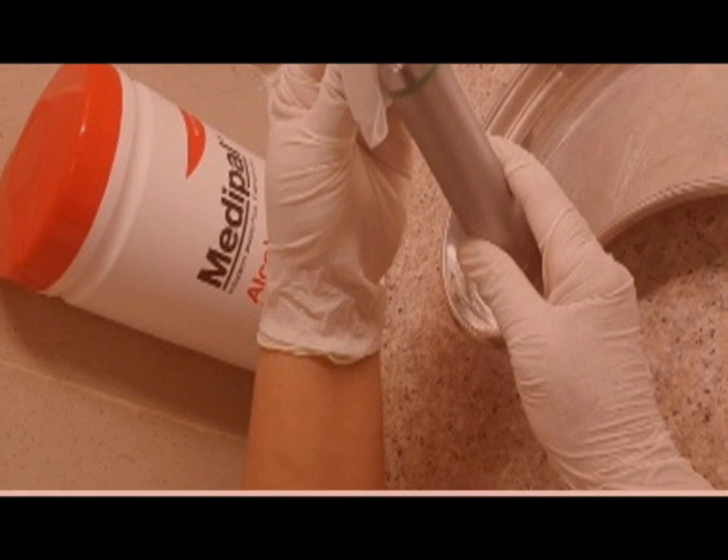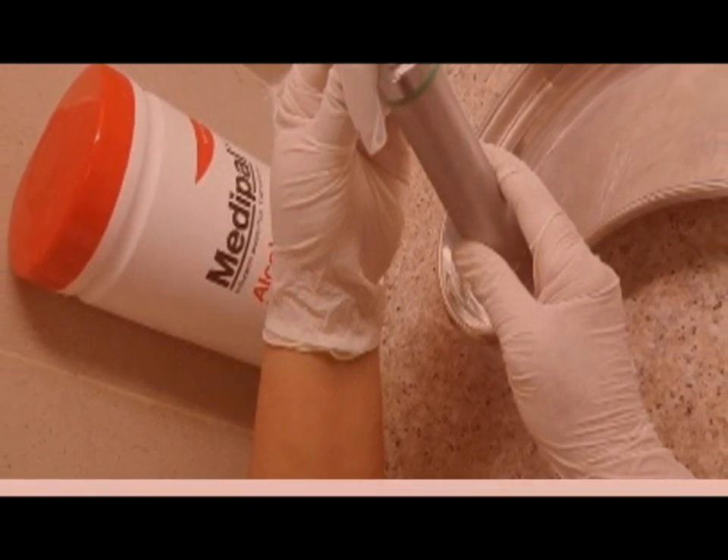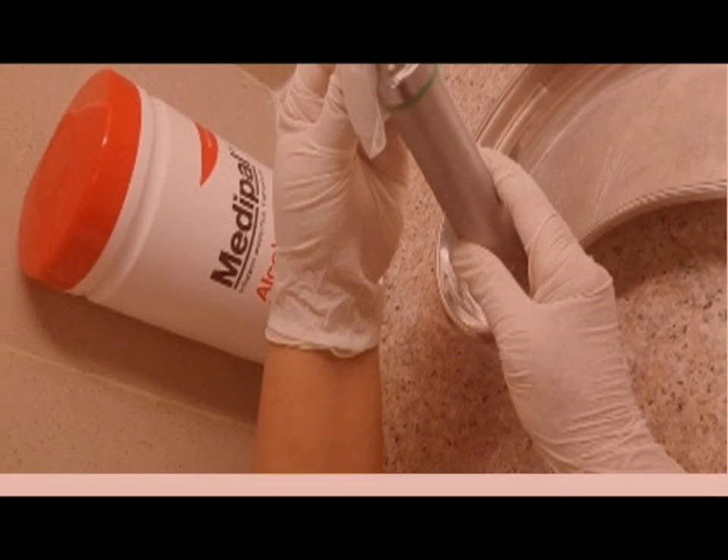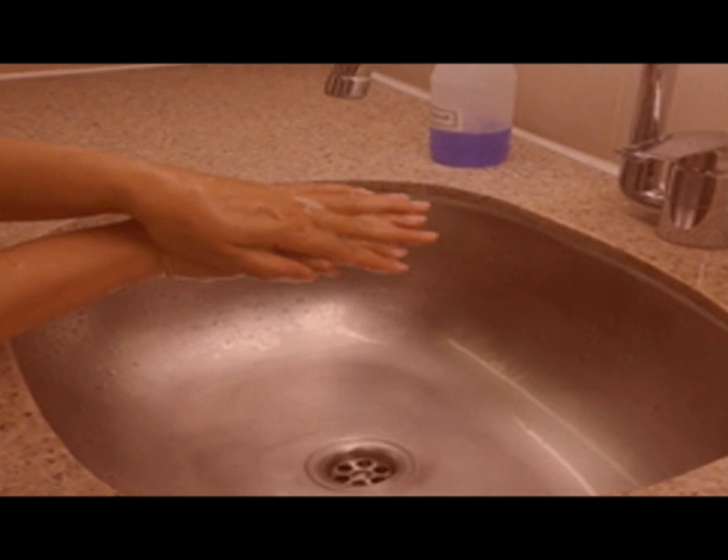The handle of the laryngeal blade must be cleaned with wipes. After the procedure, wash your hands.